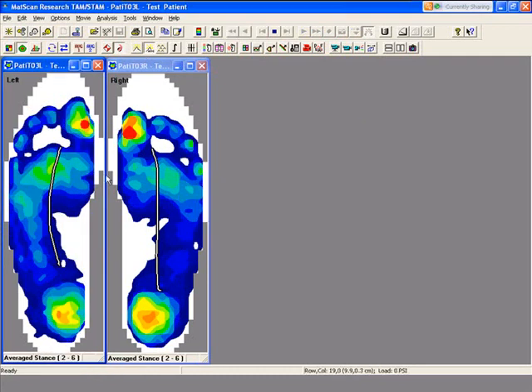Do an average, and now you can look at the average pressure distribution and the average center of force trajectory line.